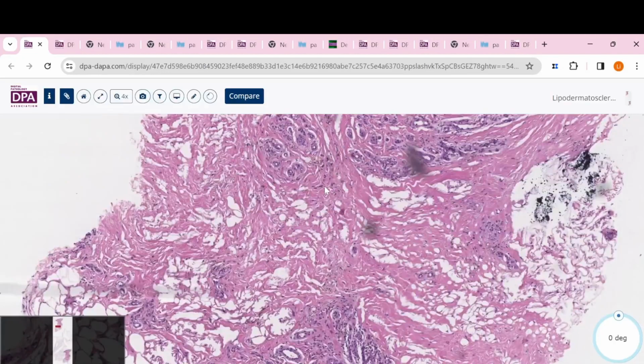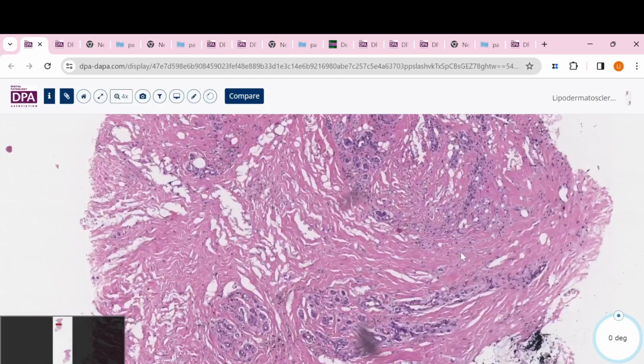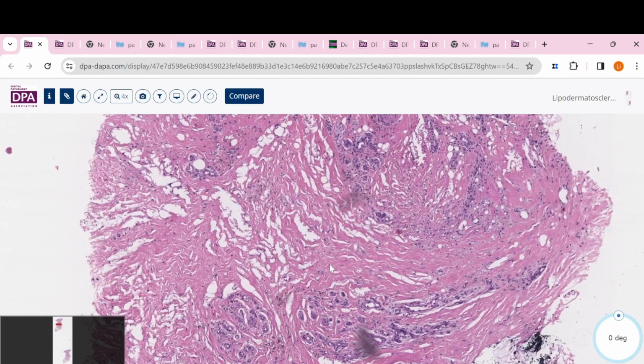And then another change, you can see in this dermis. Usually in the dermis, we should see some fibroblasts. That means in this pink material, we need to have more nuclei staying inside. But you can see some of this collagen just loses its nucleus. That is one of the changes we call the sclerotic changes. So this is not just fibroblast proliferation, because they lose their nucleus, it is just thickened collagen without nuclei.